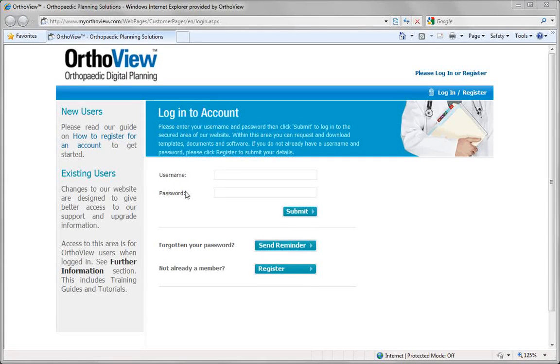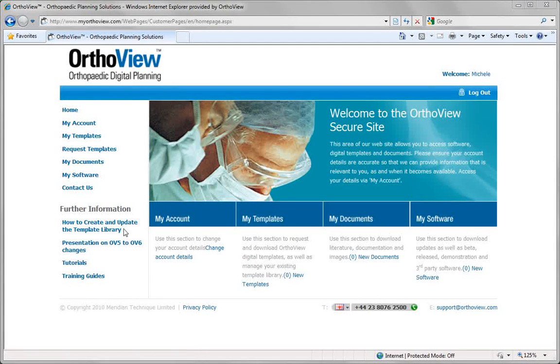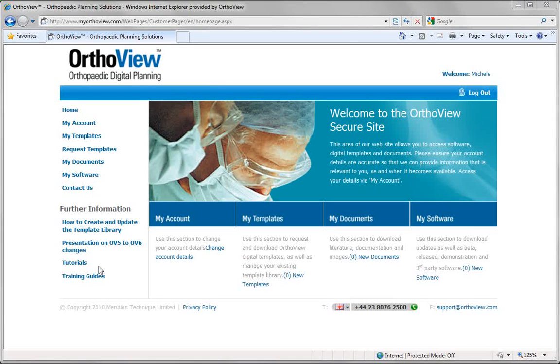Once registered, log in with your username and password and submit. When logged in, there is further information on how to create and update your template library, a presentation on version 5 to version 6 changes, plus access to the tutorials you are currently viewing and training guides.